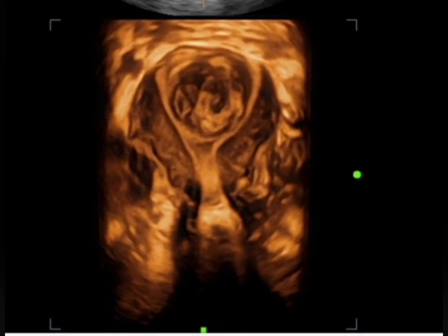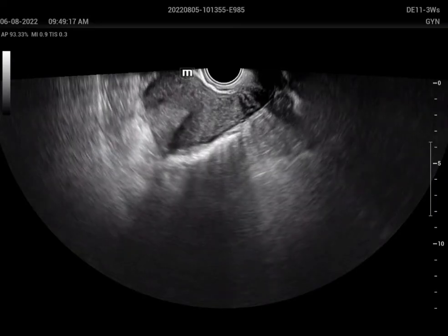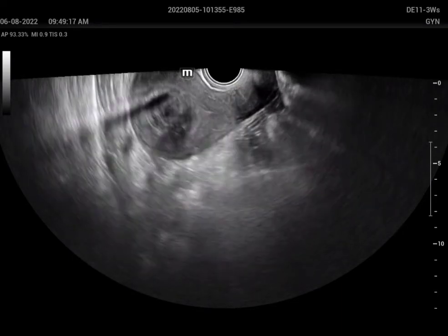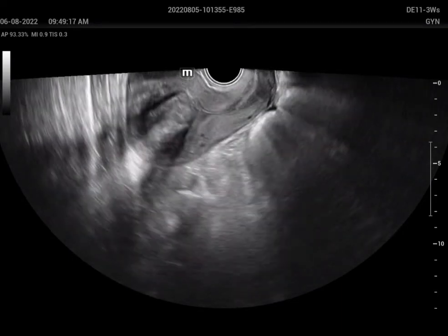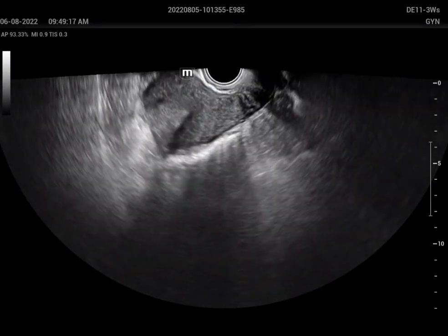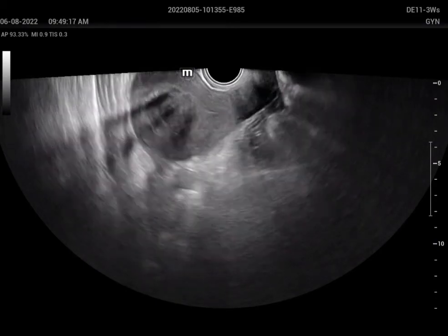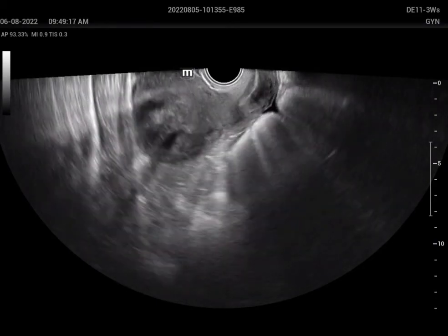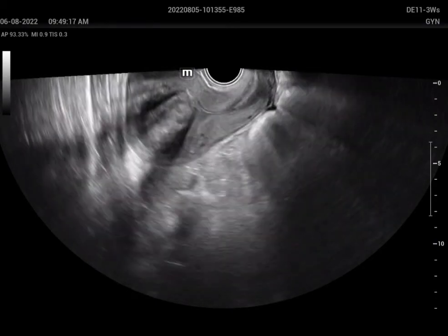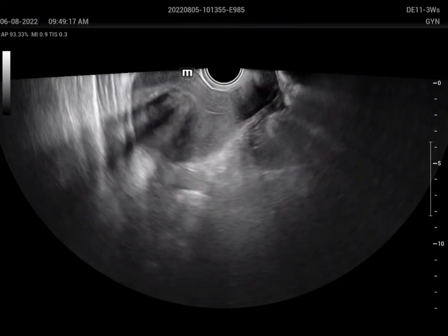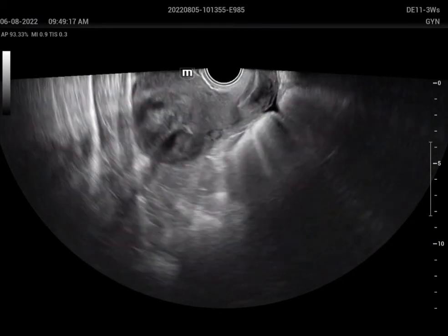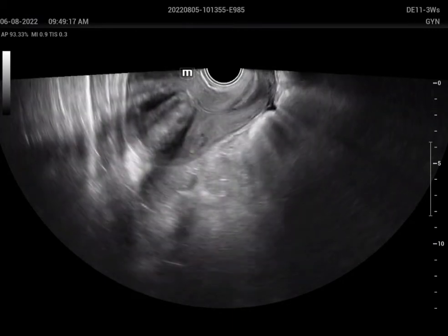Hello everyone. Today we have a case of submucosal fibroid, and we are going to discuss how to optimize your machine to get the best 3D/4D image. You can see a well-defined lesion in the endometrium on the 2D image.